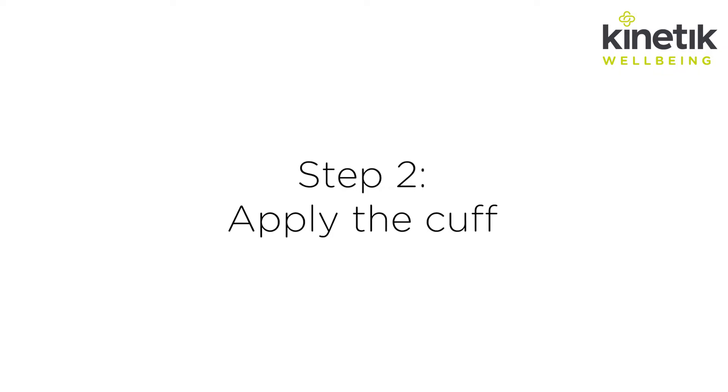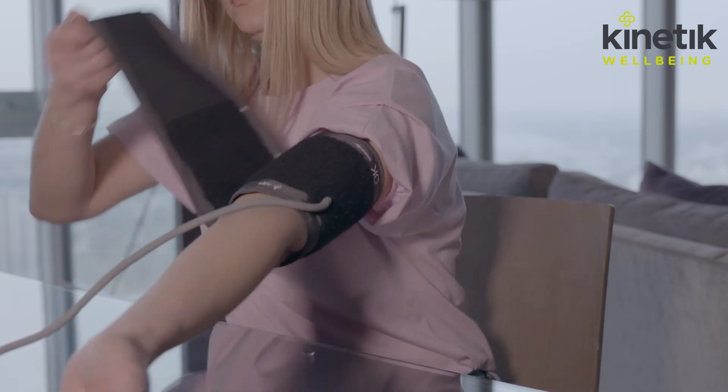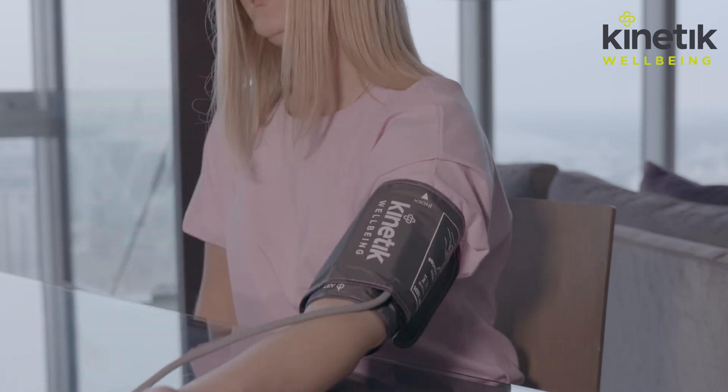Step two: apply the cuff. Use your left arm, making sure to remove any thick clothing, and rest your arm on a hard surface.